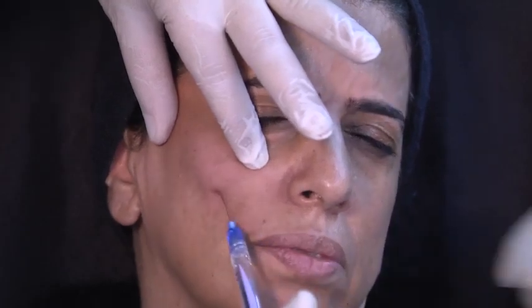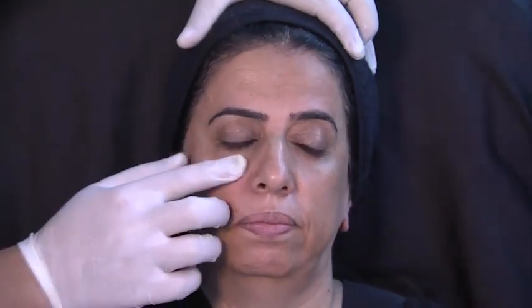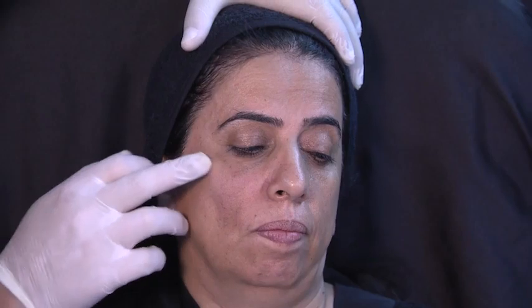I don't want any visible product. Now, you can see how visible was this bolus, and this is defined. Imagine if we injected Lift in this area. It would have been really visible and unnatural. That was the reason why I decided to choose the OBT range. That's it.